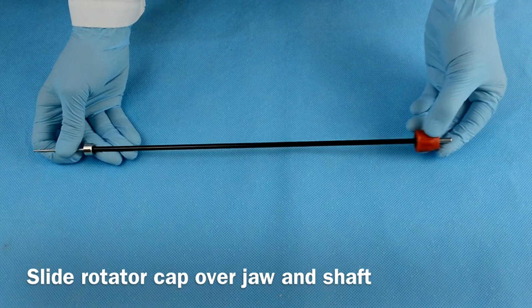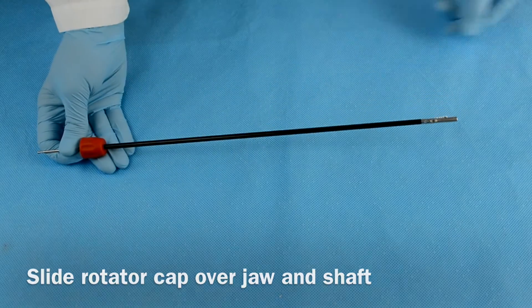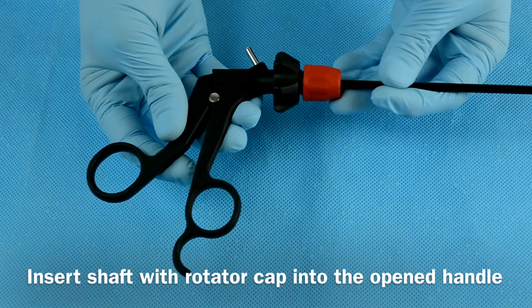Next, slide the rotator cap over the jaw and shaft until it reaches the opposite end. Then, insert the shaft with the rotator cap into the fully extended handle.